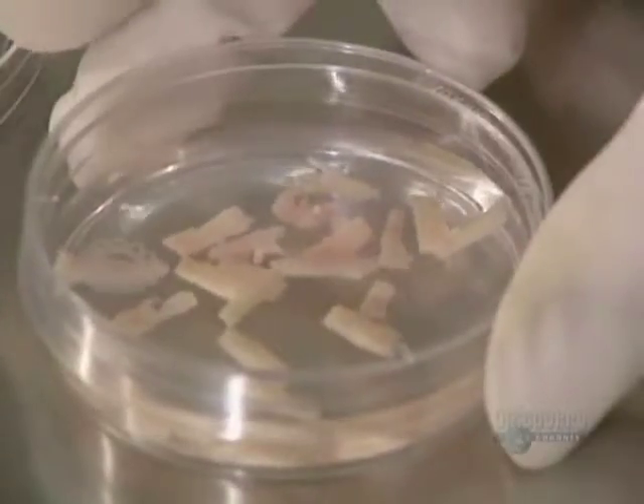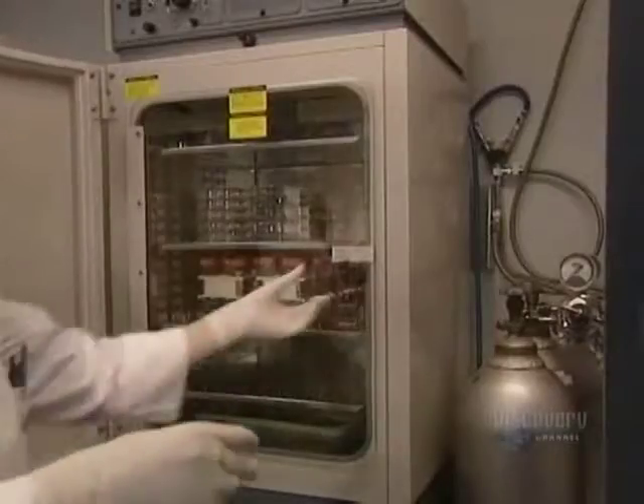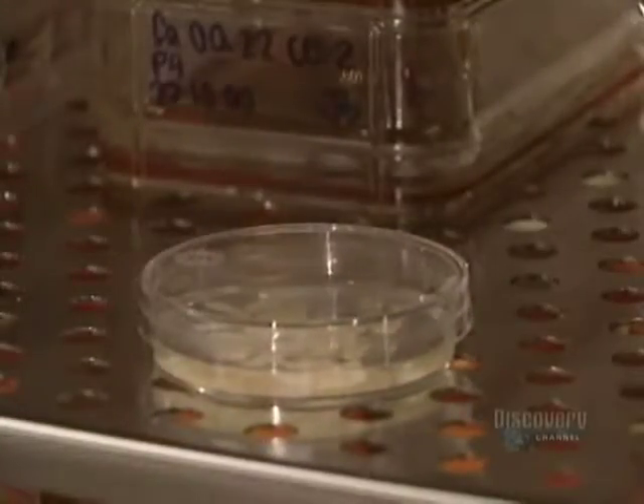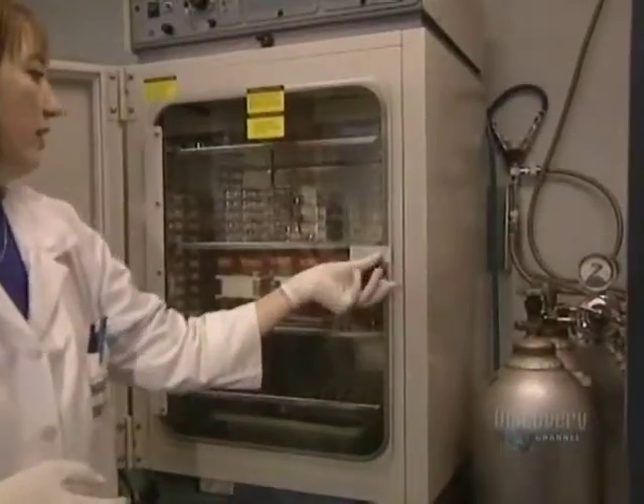Then an enzyme destroys the links uniting the dermis and epidermis cells. This procedure is carried out in an incubator over 3 hours at a temperature of 37 degrees centigrade.